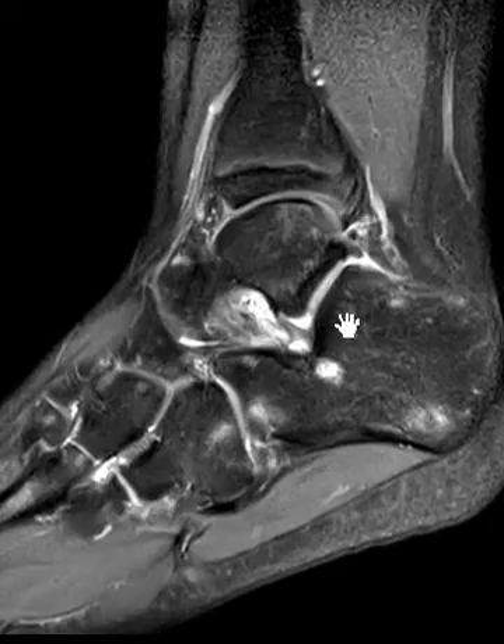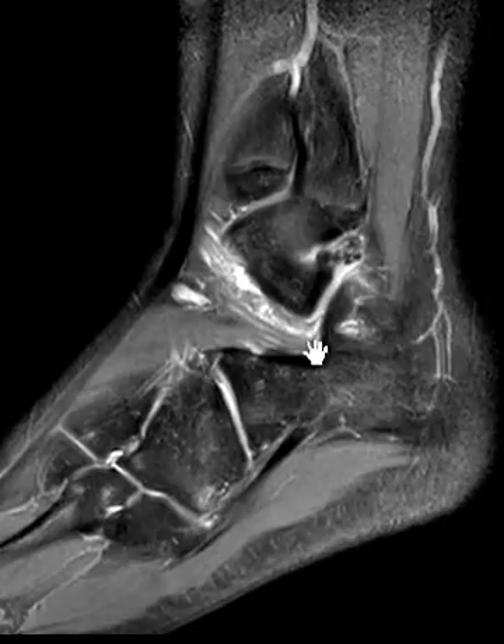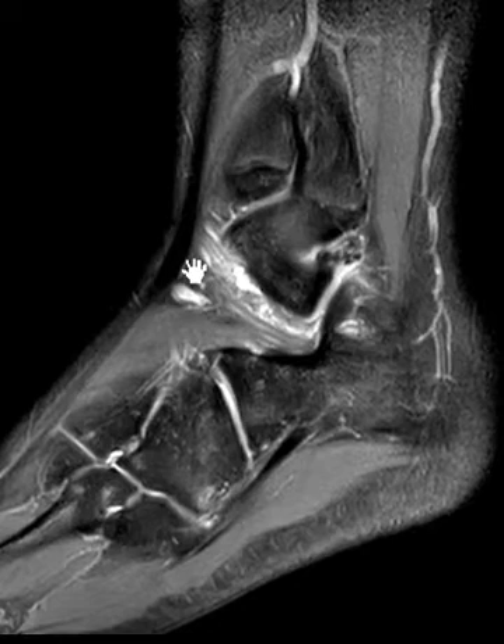Now going to the sagittal T2-weighted sequence to look at the sinus tarsi components. Toward the anterior superficial part, we see the first component — the inferior extensor retinaculum. It's usually very thin and wispy and broad, and I don't see it super well here. I can kind of make it out up here, but not as well inferiorly — so it may be partially torn, though this structure is inherently difficult to see.